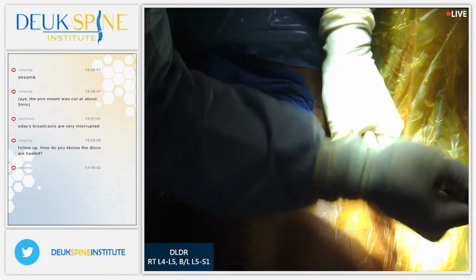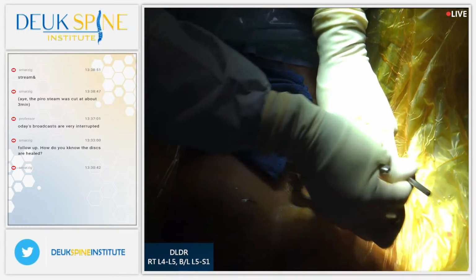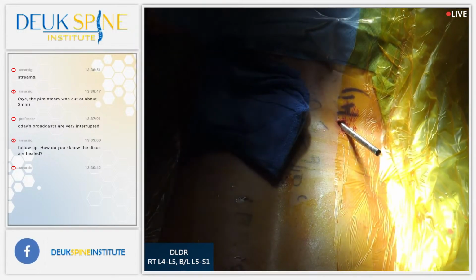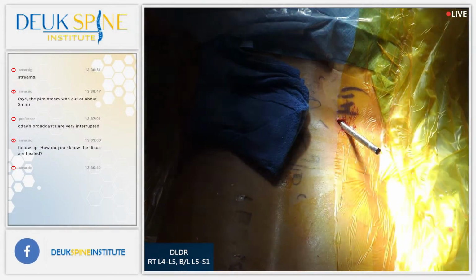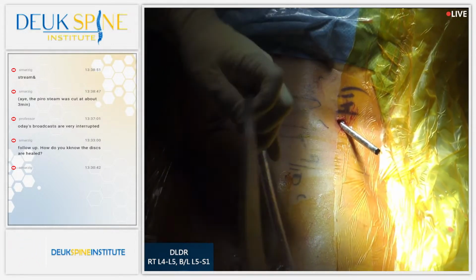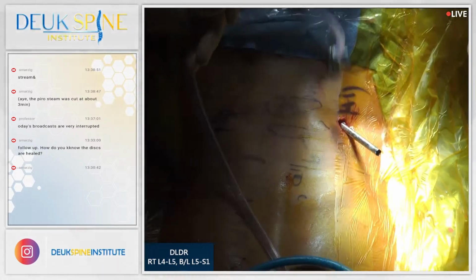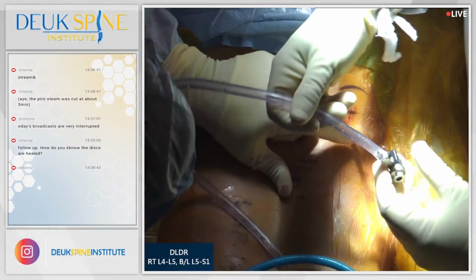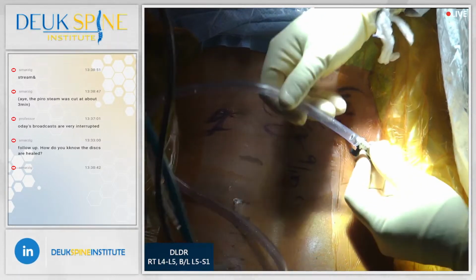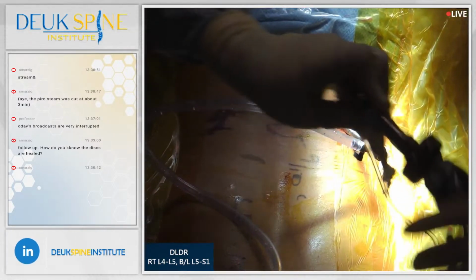If you have any questions, feel free to ask. All right, bring it out. Well, this is our last disc. We're almost done. After this, we have another patient in room 2. Yes. And then we'll be back for a thoracic patient with 2 discs. Thoracic from Miami. She has severe pain at her bra strap. She has 2 herniated discs.